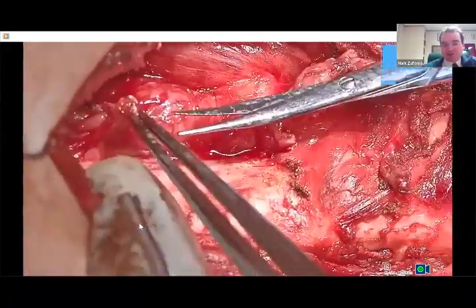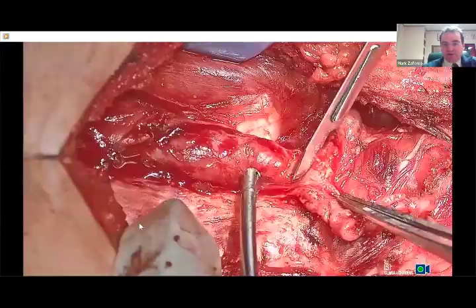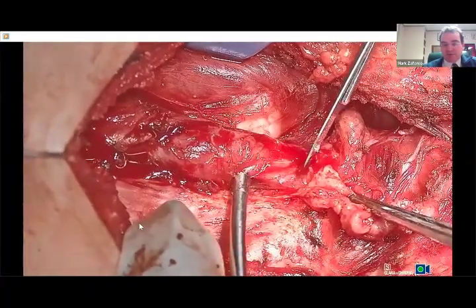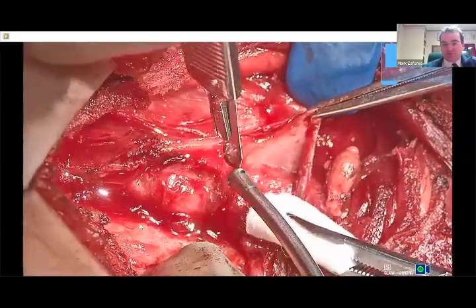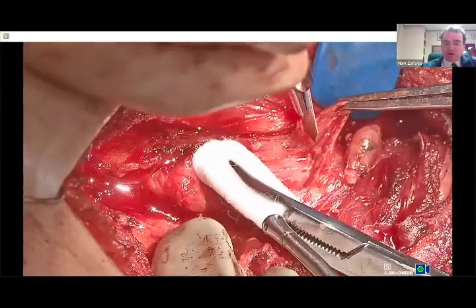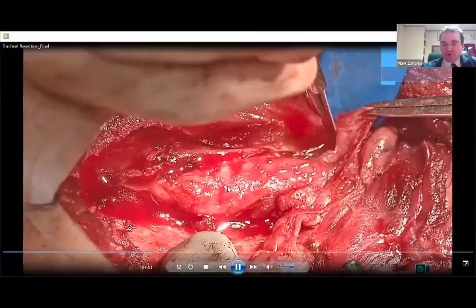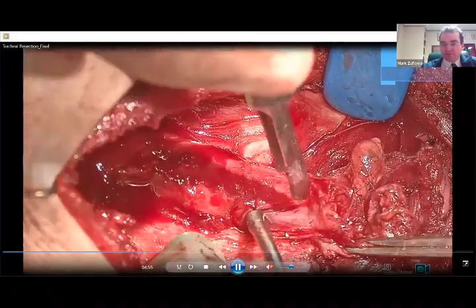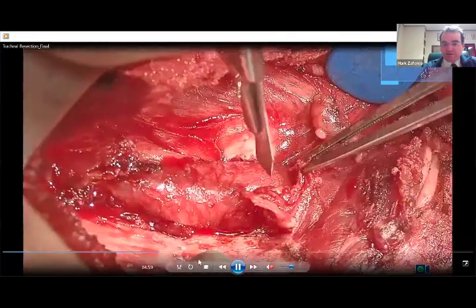I think it changes the planes, and I like dealing with a very flaccid esophagus as I'm using a knife to dissect the muscularis off of it. So this was taking some extra margins here. In this, you can see in the middle the submucosa pooching out, and this is that plane between the muscularis and the submucosa that you can get in nicely.